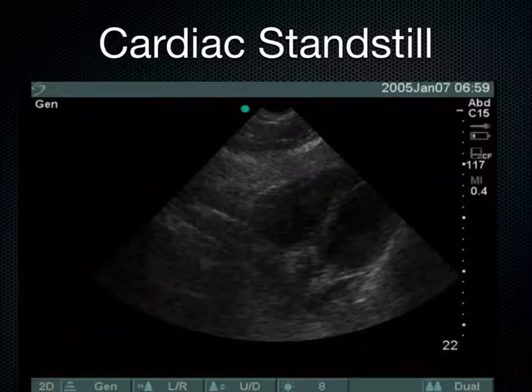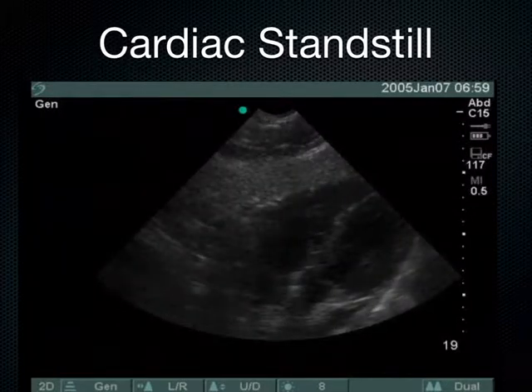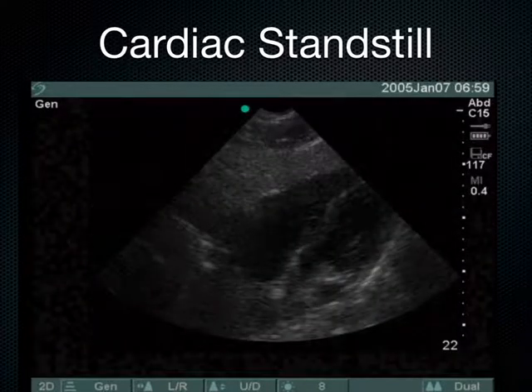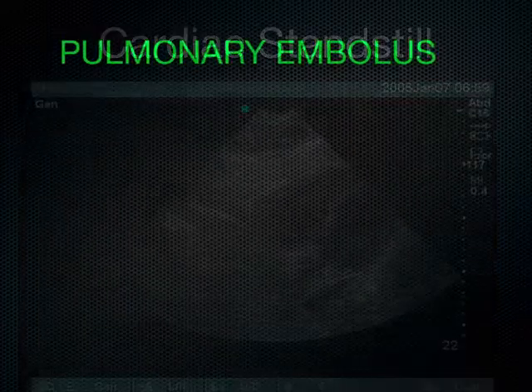And then, after we've flogged a patient for a few rounds of ACLS, if we see the heart is standing there, it sort of makes everybody feel better about stopping the code, and the family as well can be brought in, show them what a cardiac standstill looks like. That's something else to consider.